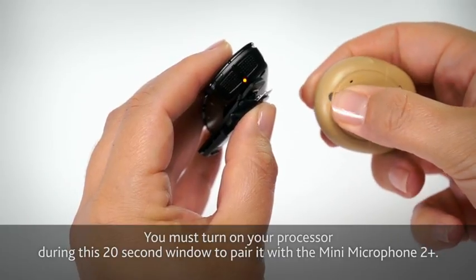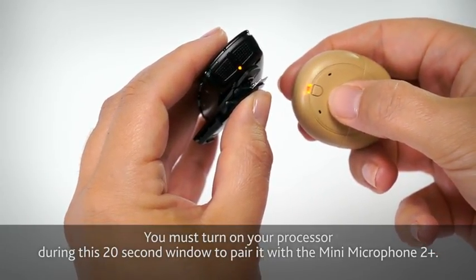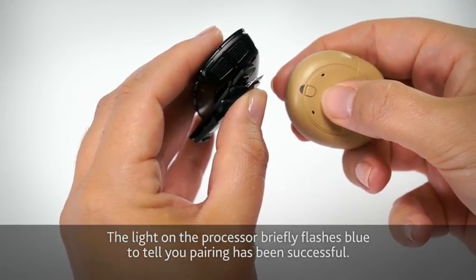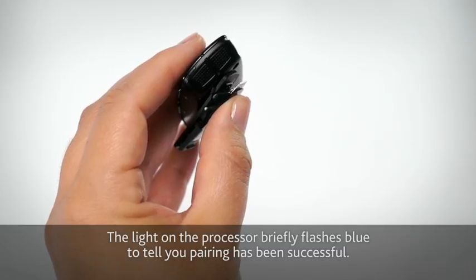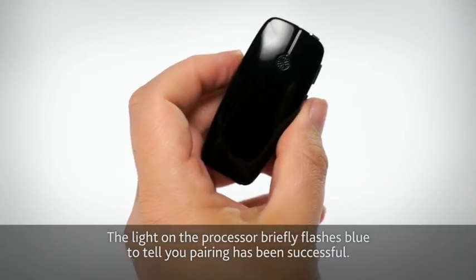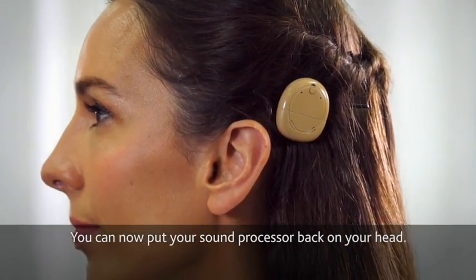You must turn on your processor during this 20 second window to pair it with the Mini Microphone 2 Plus. The light on the processor briefly flashes blue to tell you pairing has been successful. You can now put your sound processor back on your head.